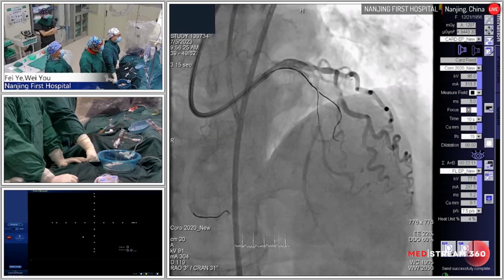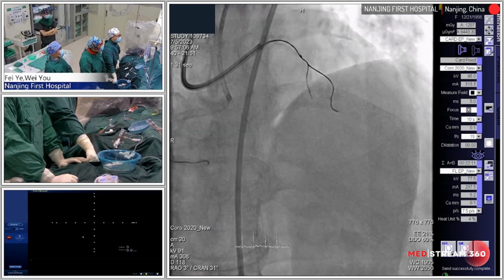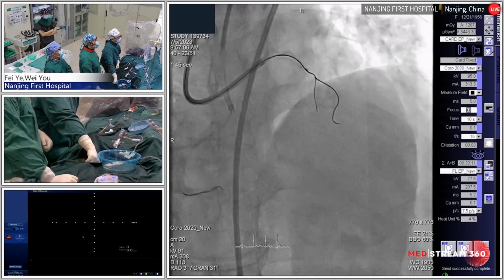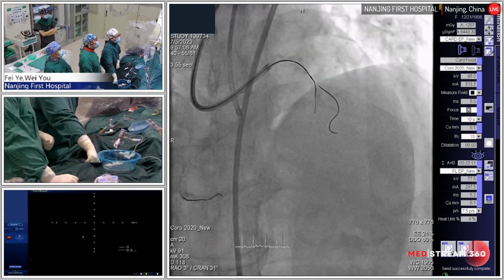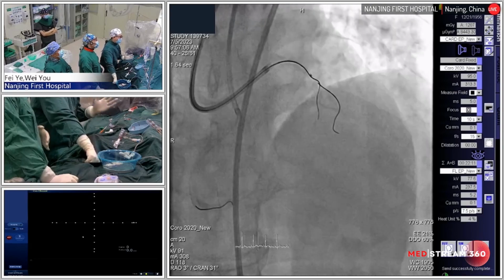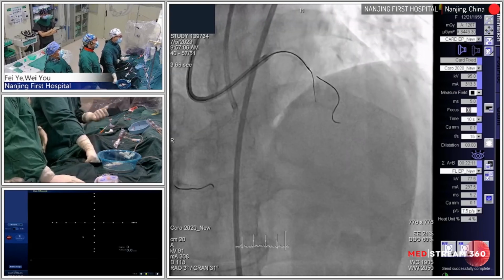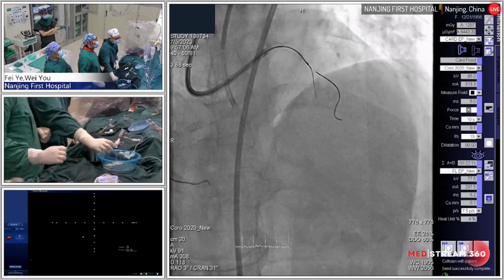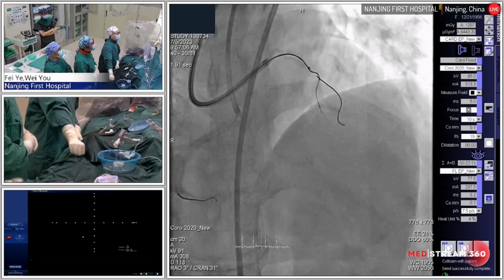Seems better. Okay, next, please. But unfortunately, with the double lumen catheter, you see, I also feel resistance from the antegrade way, and when I want to retrieve the KDL, I feel strong resistance, also like a bite.